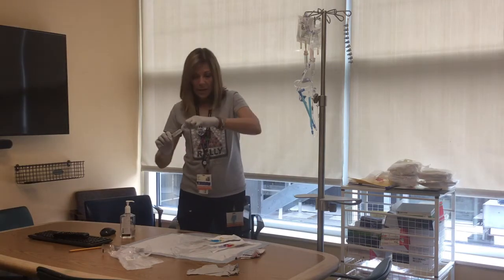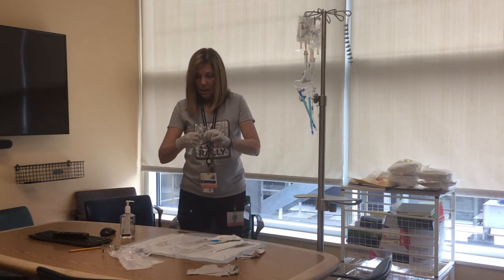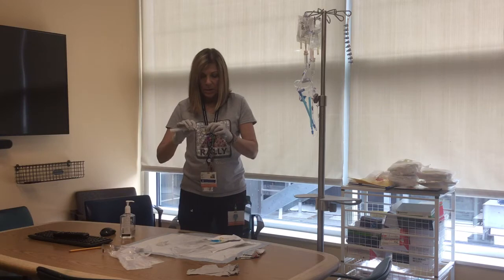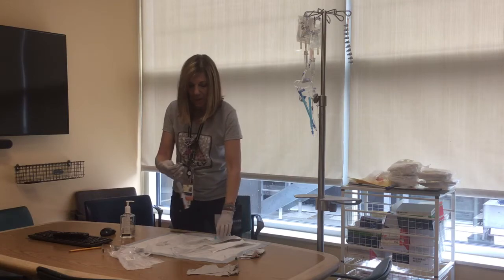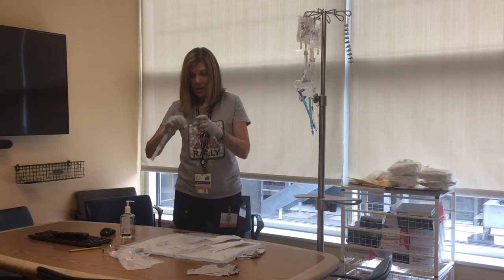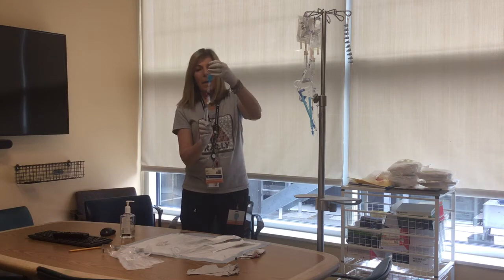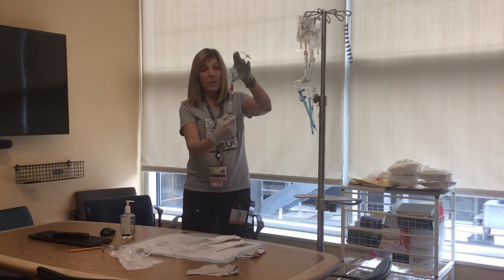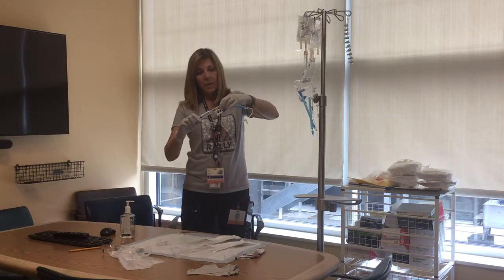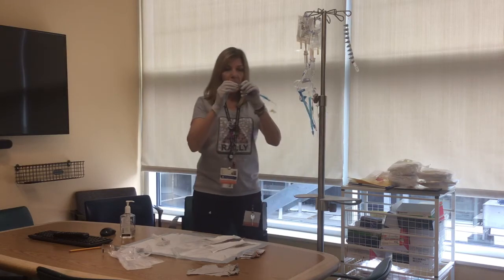You're just going to prime that to the end, attach it to your med port, clamp the ones you're not using, and attach to your filter. Then you can prime that portion — you really only have to prime it up to the Y part. Then clamp that off and cover it with the blue cap.